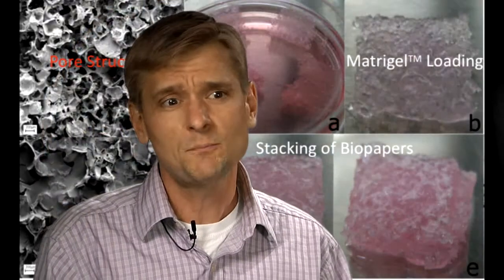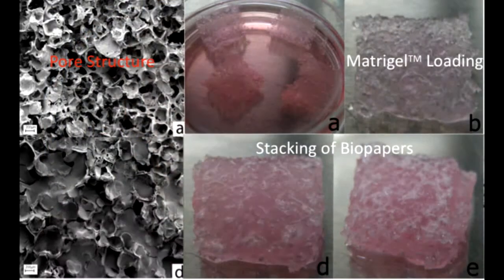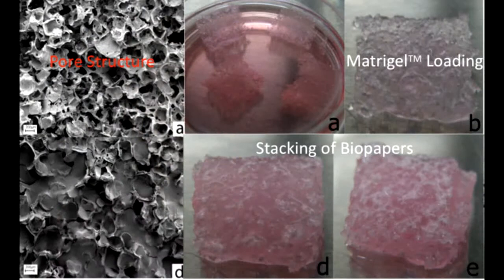Our BioPapers have a maximum pore size of about 300 microns and are technically stable enough to be loaded into a cell printer, sort of analogous to regular paper being loaded into your desktop printer. They can also support cell growth and differentiation when infused with matrigel, yet retain enough stability to be stacked into multi-layer constructs after printing and cell differentiation has occurred.